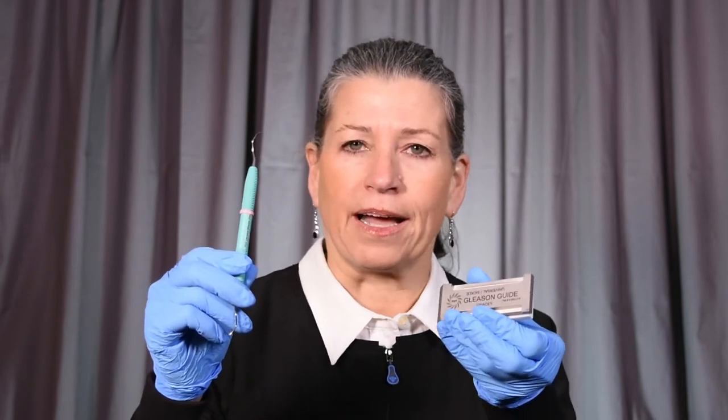Hi, I'm Linda Miller, CEO and founder of PDT, also known as Paradise Dental Technologies. Today, I'd like to show you how to sharpen our amazing Gracie curette with our Gleason guide.